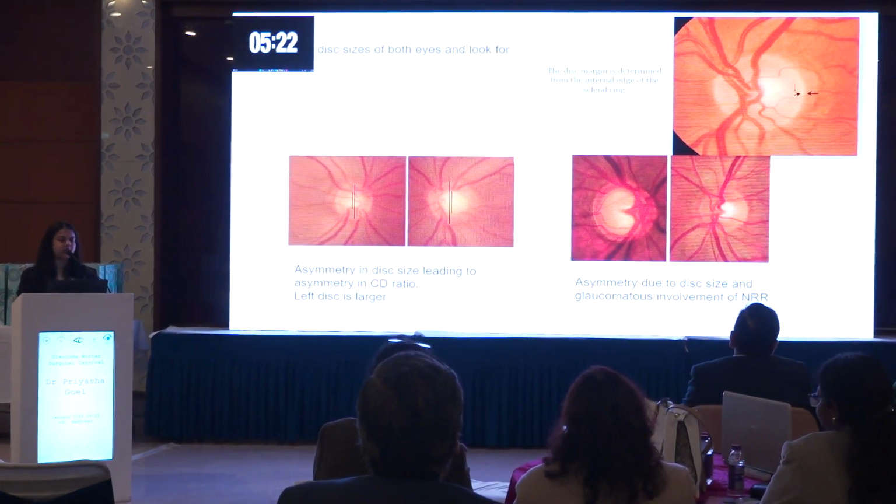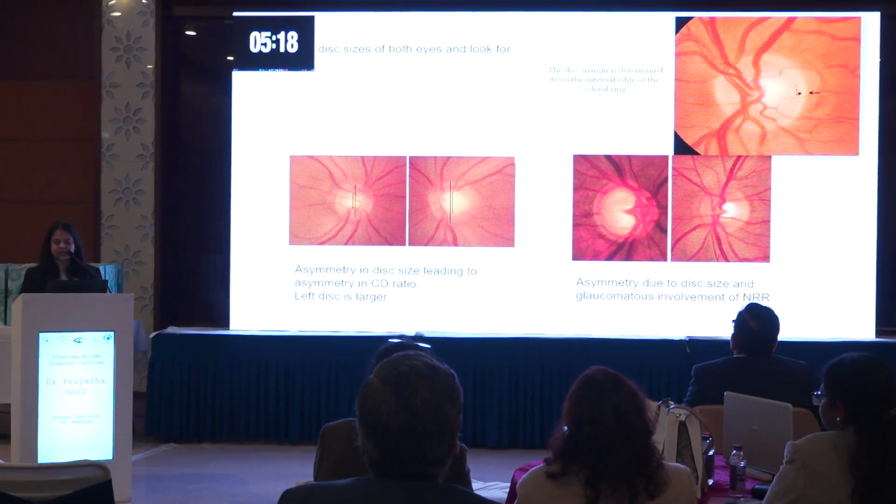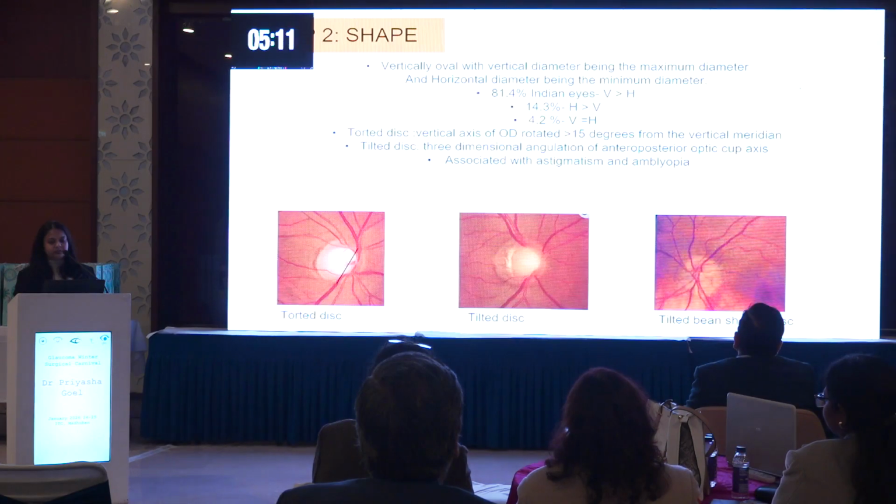The second thing to keep in mind is to compare both the discs, the right as well as the left, because sometimes the size is different, so the cup disc ratio is also different, and there can be a discrepancy in the CD ratio.